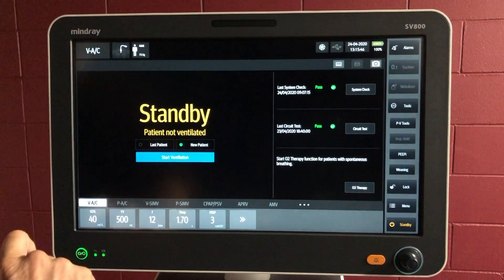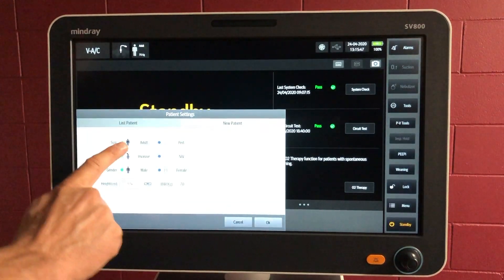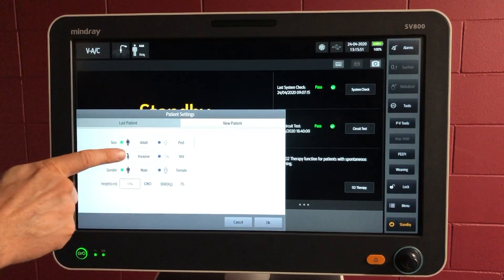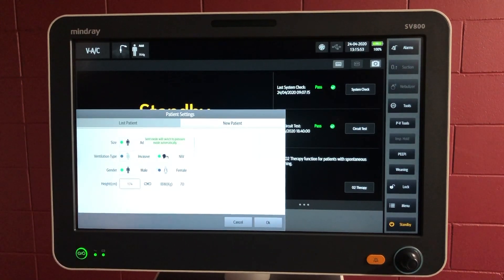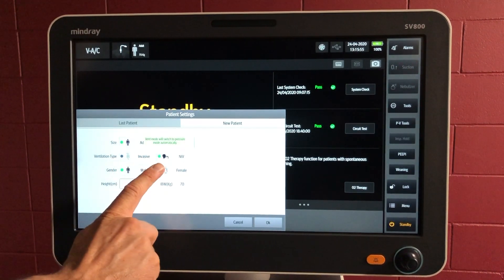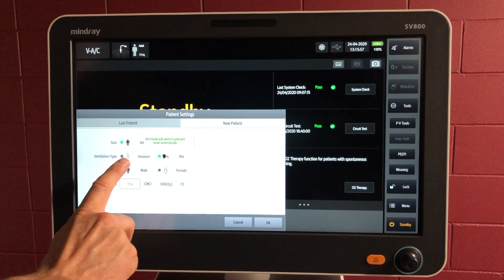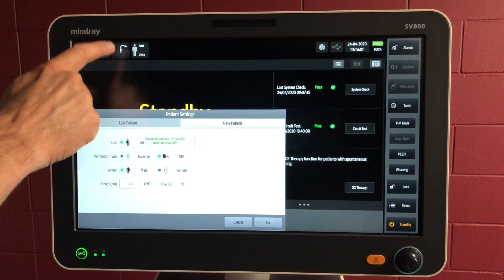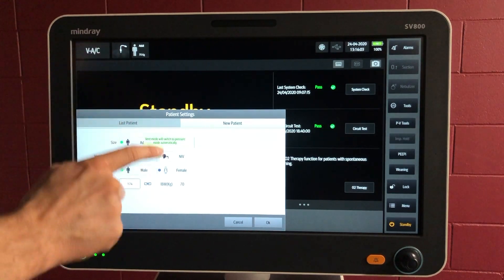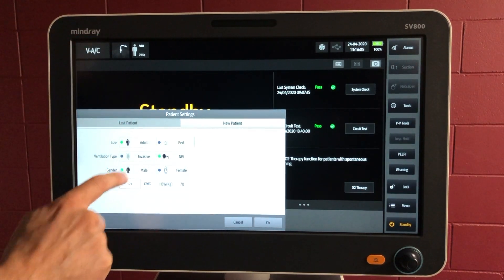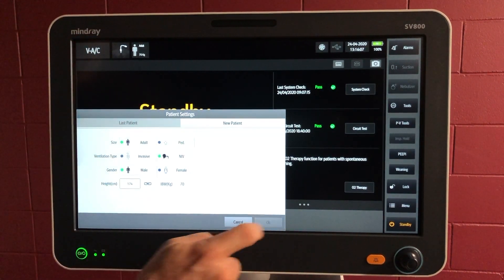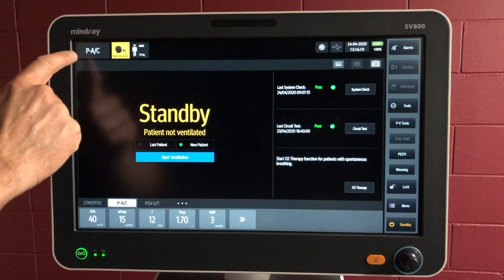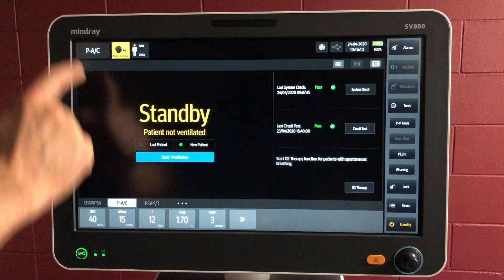We're going to choose a new patient — adult, not pediatric. Rather than invasive, we're going for non-invasive. The symbol for non-invasive is a face with a mask rather than the ET tube. You'll see the ET tube will disappear and be replaced by that symbol when we get underway. Let's go for a male of 174cm. That symbol has changed and we'll have a mode change as well.